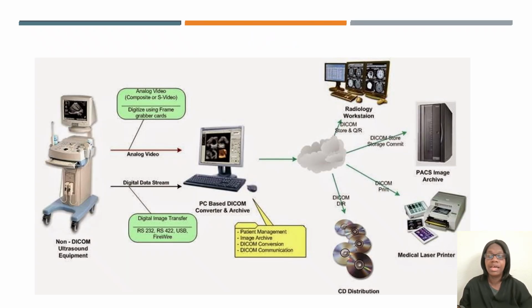All right, so how DICOM works is it works by image acquisition, meaning we have performed the radiology imaging scan or the X-ray. And then you have your data that's going to be stored and retrieved. Image sharing and viewing happens, and also data exchange. So that's what DICOM involves.